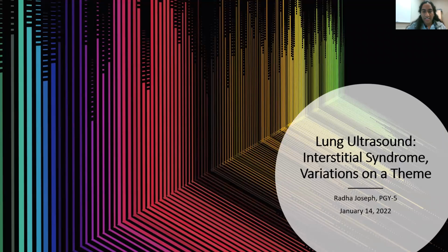So without further delay, I'll get started. So the topic today is lung ultrasound, specifically interstitial syndrome, what I'm calling variations on a theme, bringing me back to my piano playing days, but that's what came to mind when I was looking through this topic.